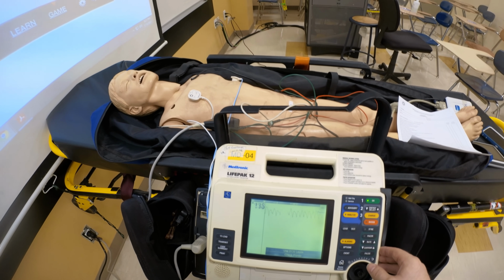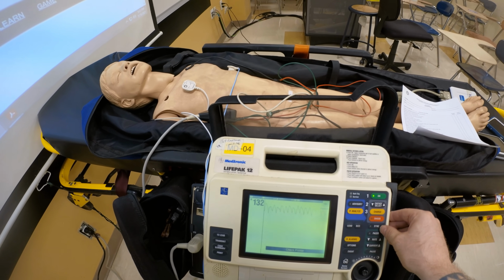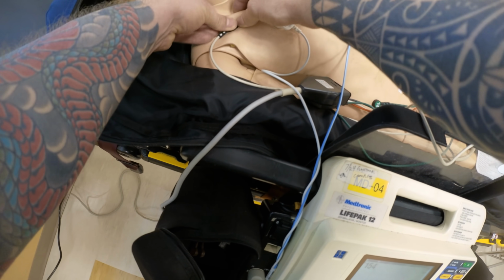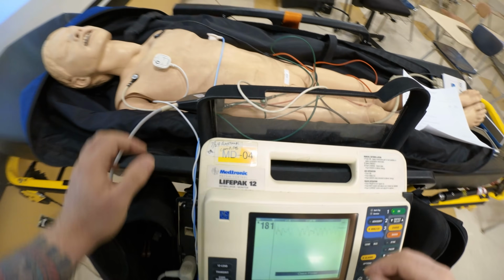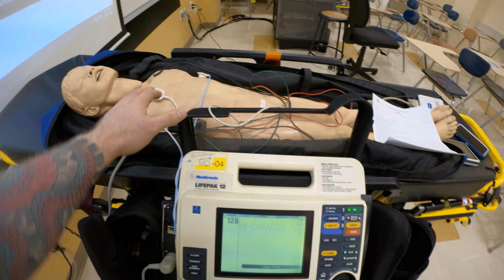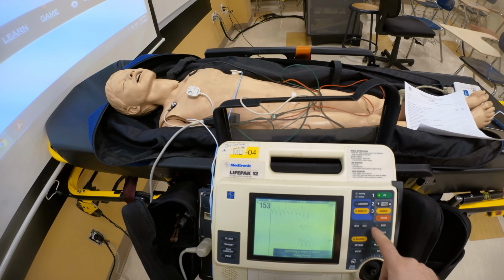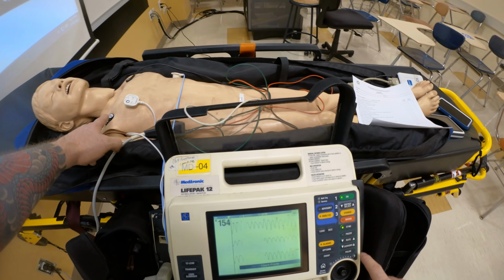So the student will be confused, like, I want to sync, your monitor is broken. No, the monitor is not broken. What you need to explain is that your limb leads must be together with the pads. The reason why is that this monitor cannot both sense and provide therapy by pads alone. So now I'm able to do it. Now the sync comes in the moment my pads are on.